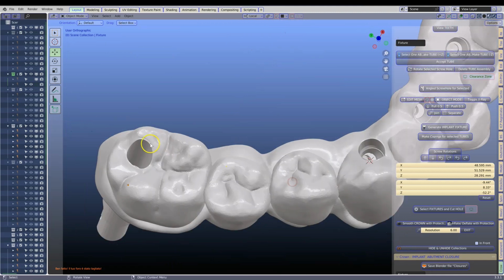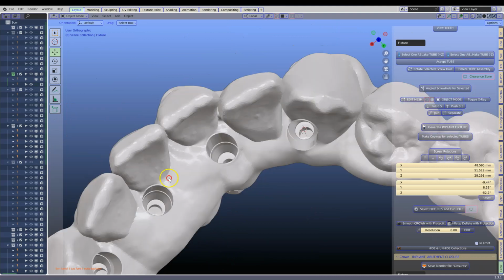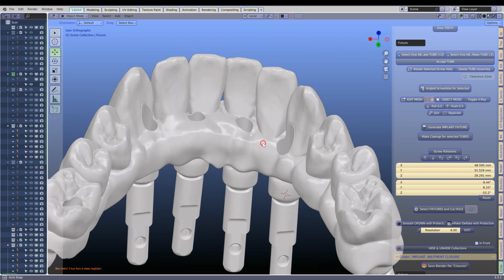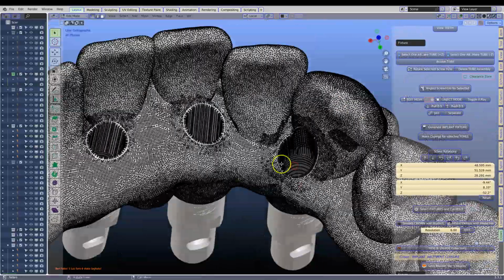So here we can see the mesh where we've smoothed. Over here as well, we've got a perfect hole. And that completes it. In edit mode, this is what it looks like. Beautiful.